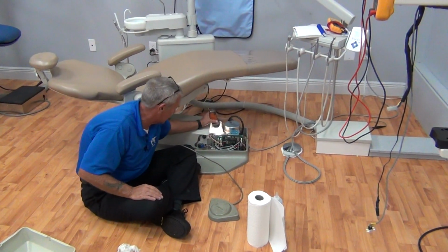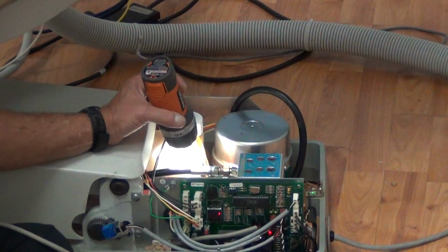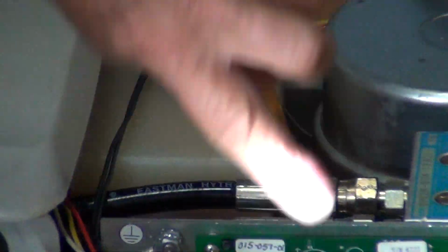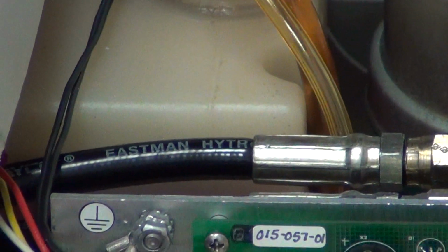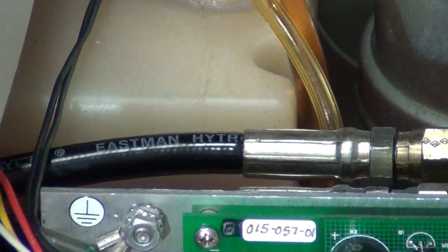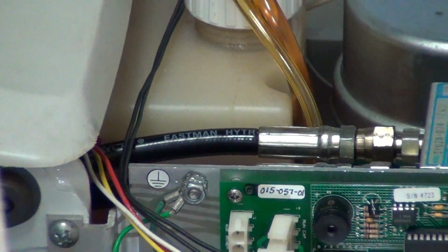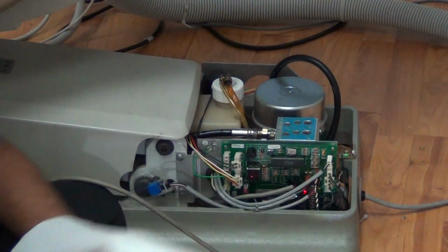We're going to take our flashlight, and this reservoir is perfectly topped off. You'll see gradients on the side of the reservoir. We have a fluid level about 1 segment of a finger down, which is wonderful. But briefly, let me go over the oiling procedure with you on this particular chair. Now, you've already got paper towels here. Whenever you're working around hydraulics, guys, rags, paper towels, okay?